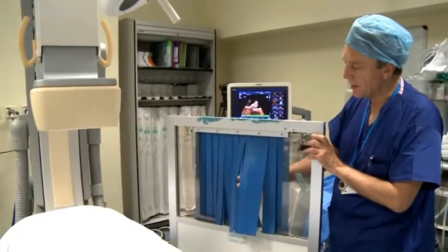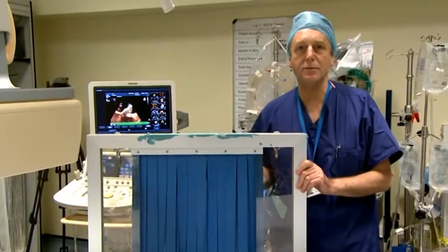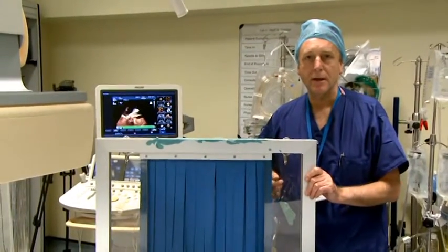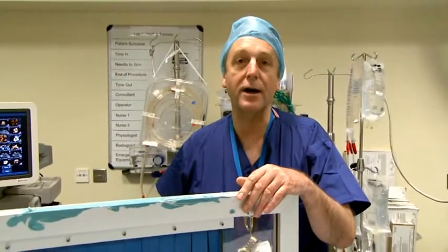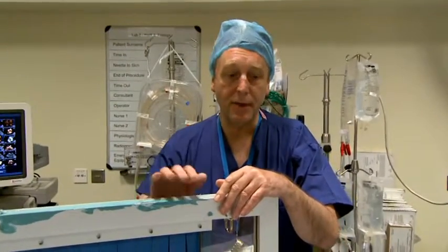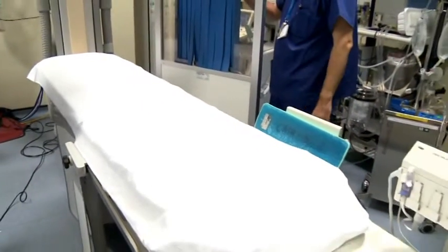Now we've had this constructed to allow us to manipulate the probe at the same time as giving us maximum X-ray protection, because there's no doubt that the echocardiographer during these procedures receives probably the highest dose of anyone in the lab. We also have a lead shield down here to protect the lower extremities from radiation as well.